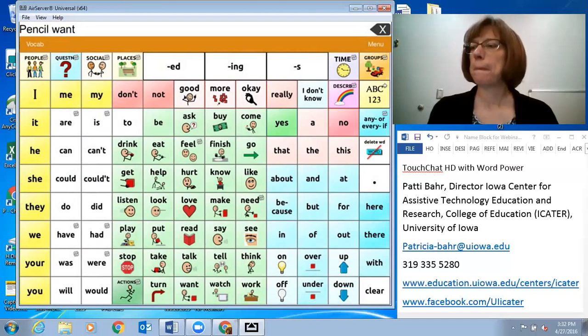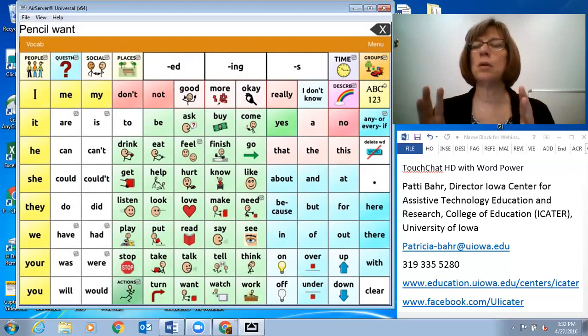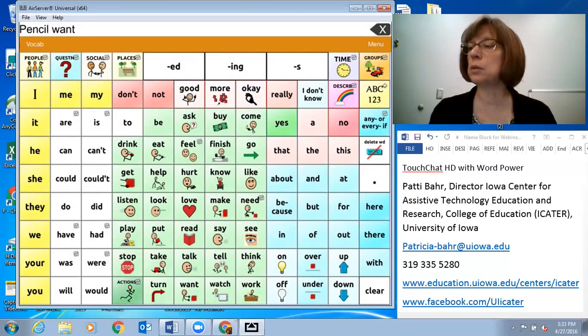So anyway, a really versatile, robust augmentative communication app. It's kind of expensive, but if you're thinking about some of the products from Saltillo, the iPad is about the size of their 10-inch device. The iPad mini is about the size of their 7-inch device. So depending on what your funding source is and how your students, your people with disabilities, your people with complex communication needs are going to be using this, this might be a nice option for you.